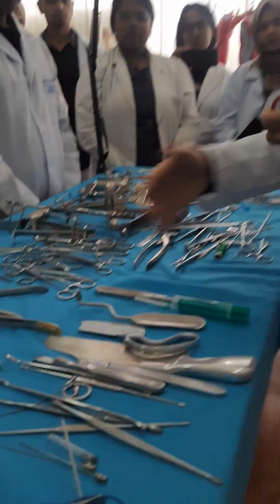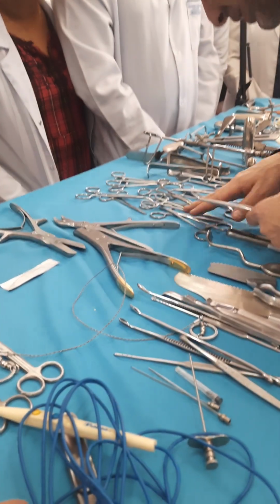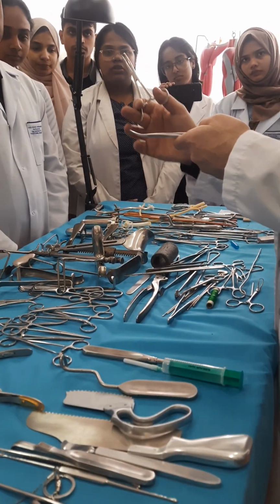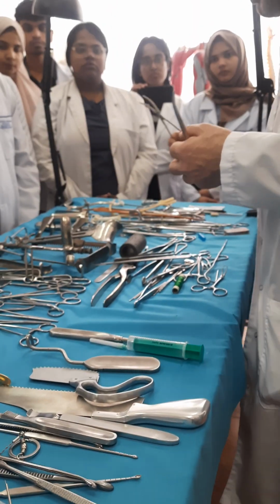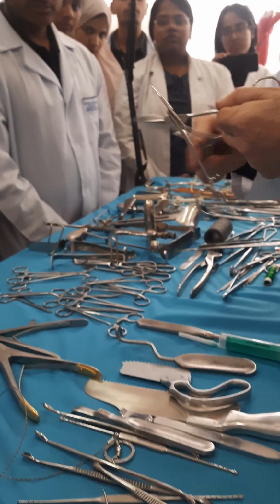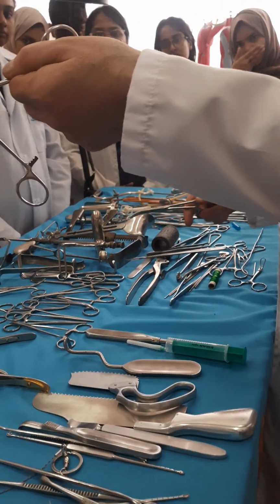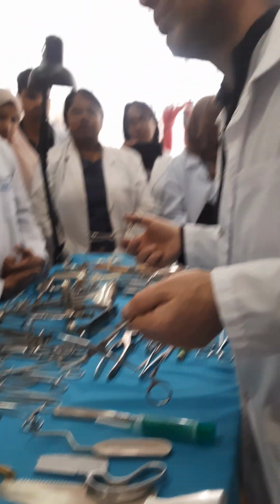But now just remember how we make the classification of these artery forceps. They can be straight, they can be curved by the tip, they can be blunt, they can be sharp, we call it mosquito. And much more important, by inner surface. You can see it can have only grooves, it can have teeth, it can have nothing. This one is Billroth, this one is Kocher. If nothing, we call it Pean.